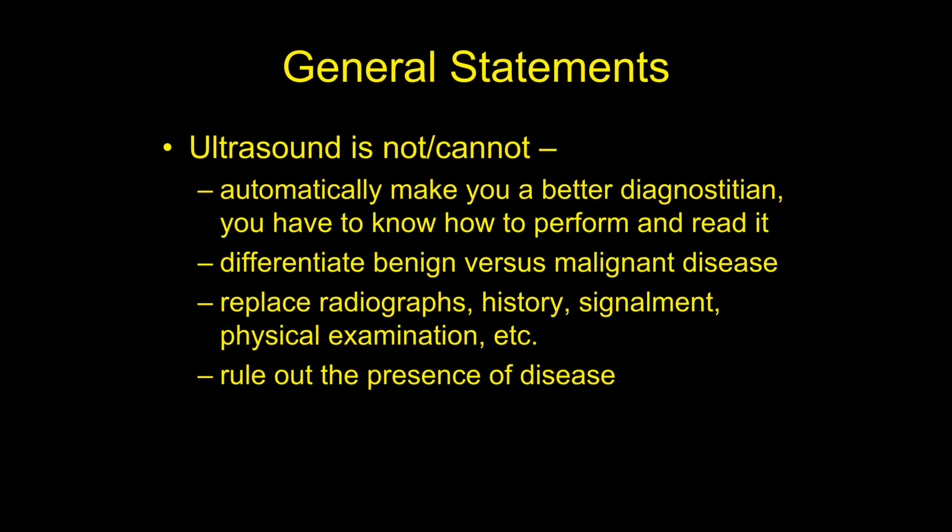But even then, it's not 100%, but it's pretty close. Okay. Ultrasound, just because you have ultrasound doesn't mean you never have to shoot another X-ray. Again, that typical scenario, that vomiting Labrador that comes in on Friday night at 5 o'clock, I would still recommend shooting X-rays first. That's your first diagnostic tool: let's shoot some X-rays first, and then let's do an ultrasound if we need to after the X-rays. So it's not going to replace radiographs.